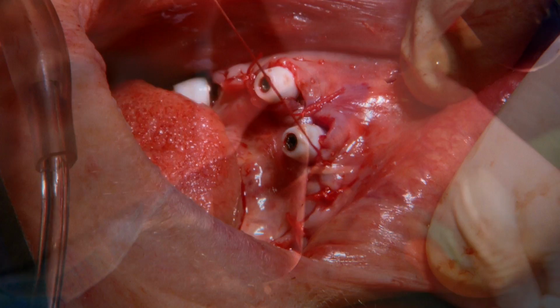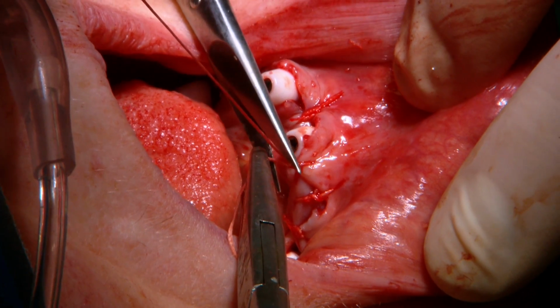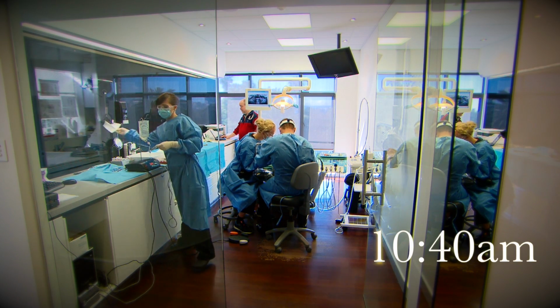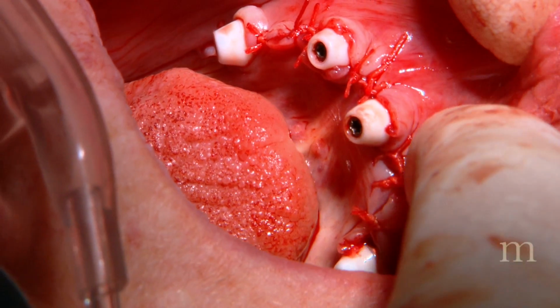So there you have it. You can see it all looks quite neat now. The tissues have been closed with sutures. You've got the 4 implants and connectors, the connectors poking through the gum. And we move on to the next stage now, which is fitting of the surgical guide and the teeth, putting them in the correct position and doing impressions around it so the technician can manufacture the final bridge.